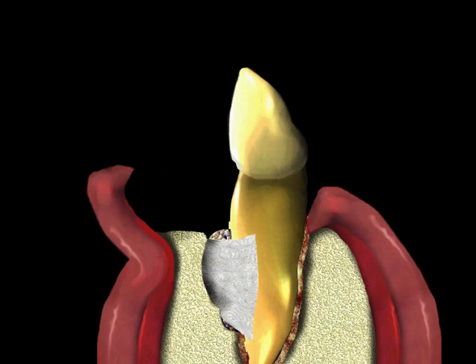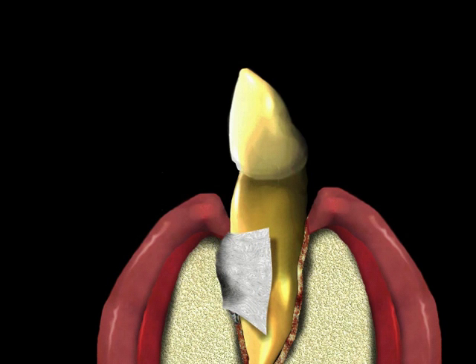To get the correct type of tissue to fill the defect, the surgery may include the placement of a membrane over the bone defect. The membrane is a special type of material that is well tolerated by your body. This membrane or barrier is used to keep soft tissue from getting into the defect. Limiting the type of tissue that can get into the defect encourages the defect to be filled with bone and connective tissue derived from bone.